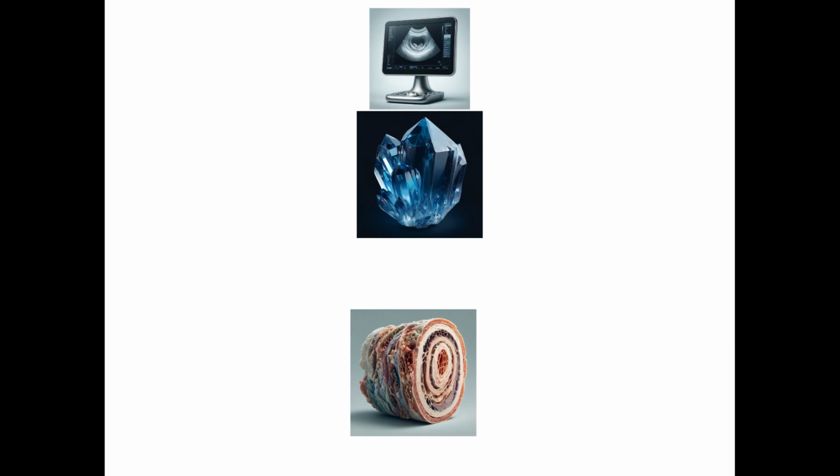Again, just to reemphasize how it works, the machine sends an electrical impulse to these piezoelectric crystals in the probe. They vibrate and produce sound that goes into this horrifying meat tissue that bounces off stuff in the tissue and returns. It causes those crystals to vibrate, right? They're sent in pulses, so it's not a continuous process, but it's a lot faster than you or I would be able to keep up with. The crystals vibrate from the returning ultrasound, and then that information is fed back into the machine, which then produces a grayscale image.